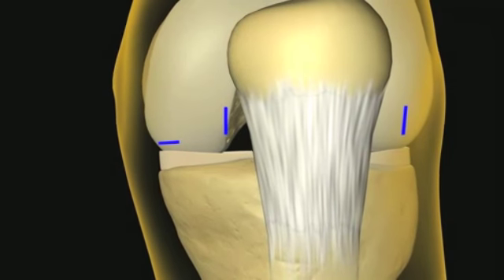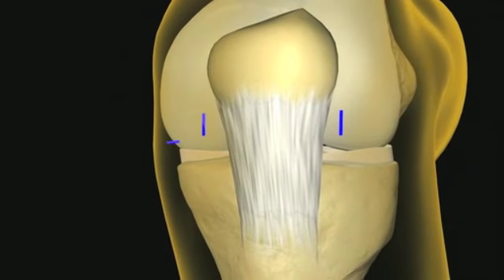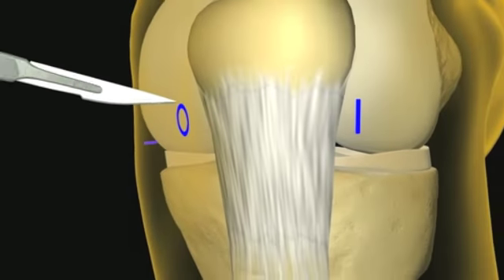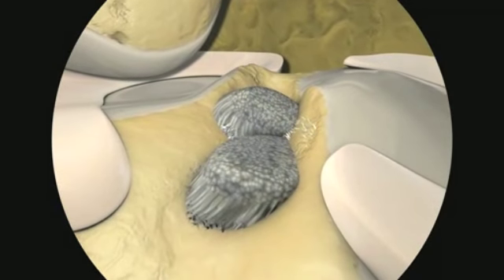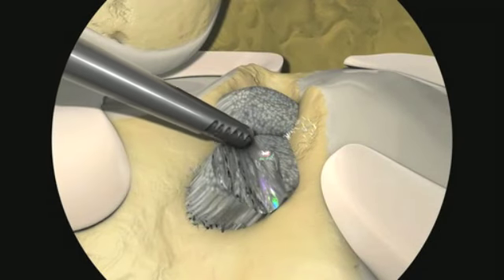The accessory anteromedial portal will be used for drilling and should be lower and more medial than the anteromedial portal. With the surgical markings in place, incise the anteromedial and anterolateral portals. Insert a ConMed Linvatec shaver to excise any remaining ACL tissue.